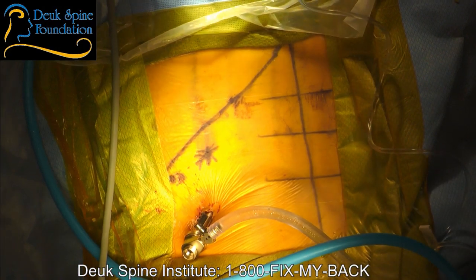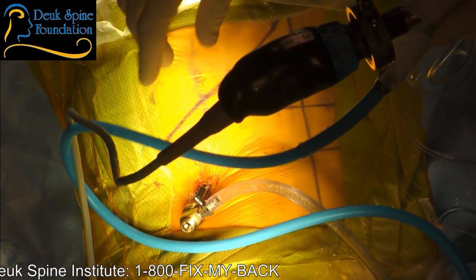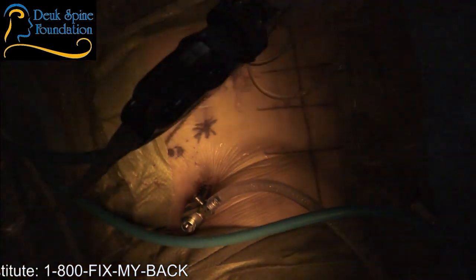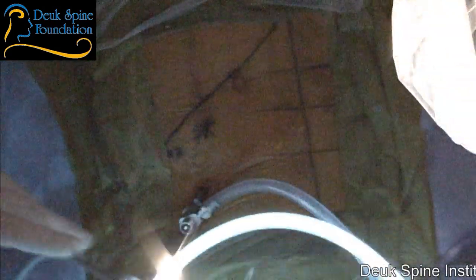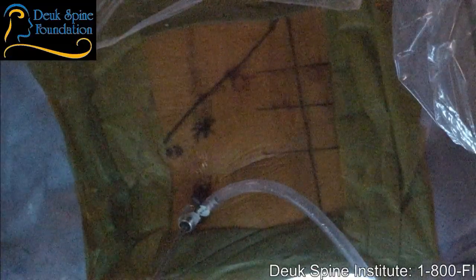All right, get the floor out, please. I think this guy has a record for the steepest. And that's just the way he was born. People are born with that. There's nothing you can do about it. It's just part of the anatomical variation that we see. I'm just happy we were able to get it done, or get it accessed at least.